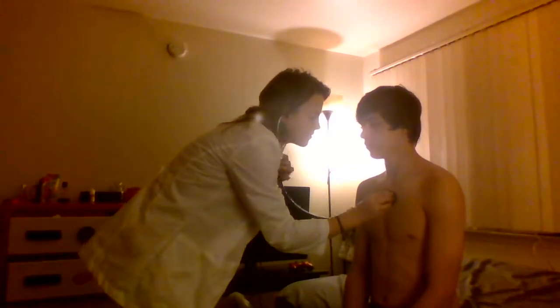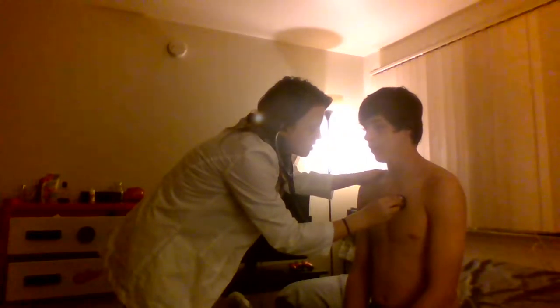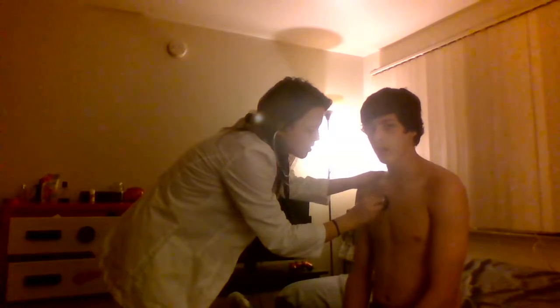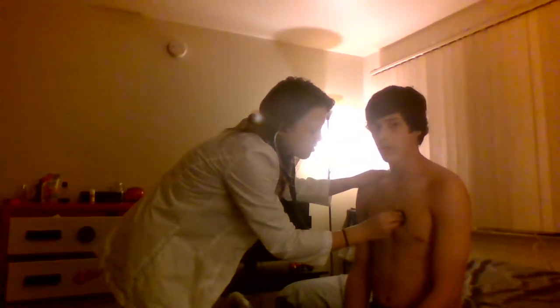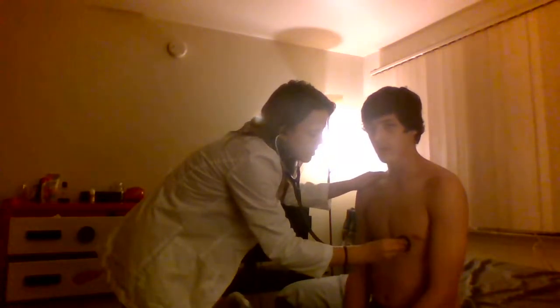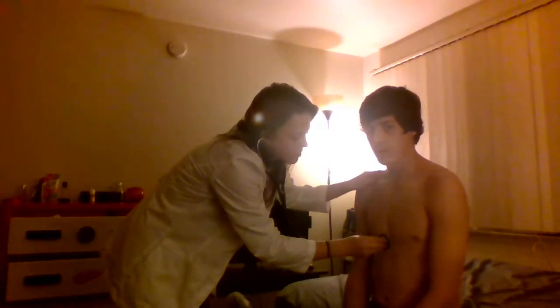While I'm going to do this, I'm just going to have you breathe in and breathe out each time I move my stethoscope, each time I'm in these spots. So I'm just going to go ahead and start with the aortic. Start usually by finding. Go ahead and breathe in. Third. You want to go to your fifth one. And now go to your last fifth intercostal space.